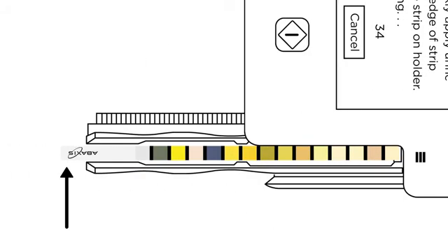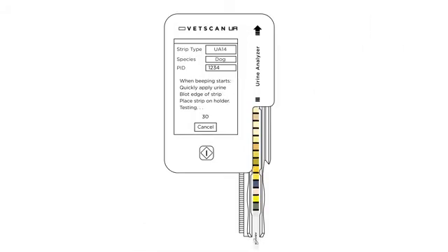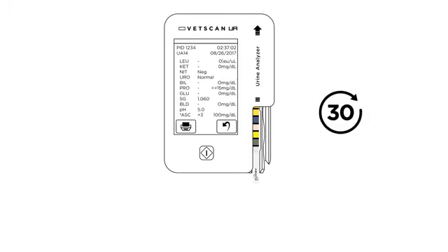The bottom of the strip will hang over the bottom of the strip tray. The tray will slide into the analyzer automatically approximately 30 seconds after the test button was pressed. Results will appear on screen in another 30 seconds, for a total test time of approximately 1 minute.